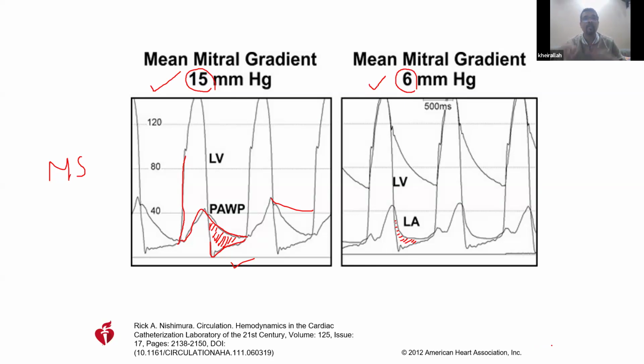Why do we get this robust difference? Maybe the tip of the catheter is lodged in the wall of the pulmonary or the pulmonary wedge. Okay, so the catheter position wasn't so proper. What else? And the delay. Sorry? The delay when taking the wedge pressure. The recording of the wedge pressure is indirect, while the LA is direct, and there is a delay.